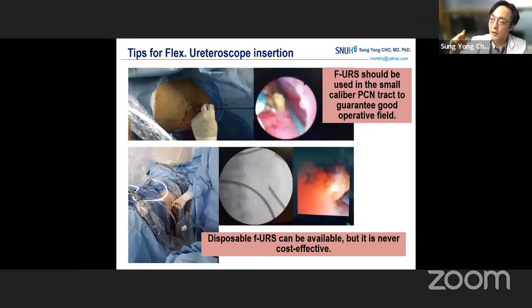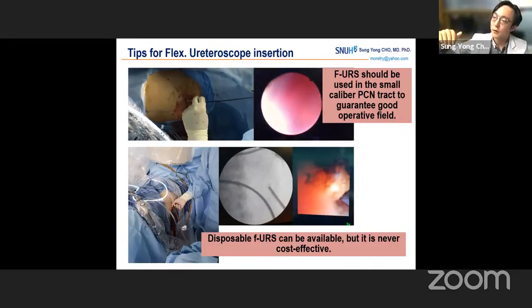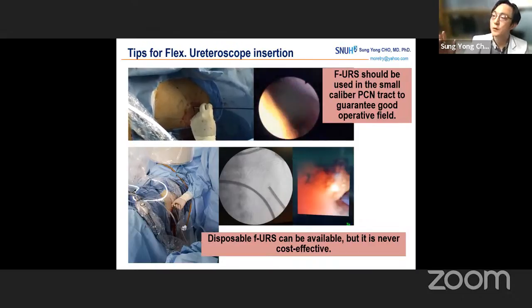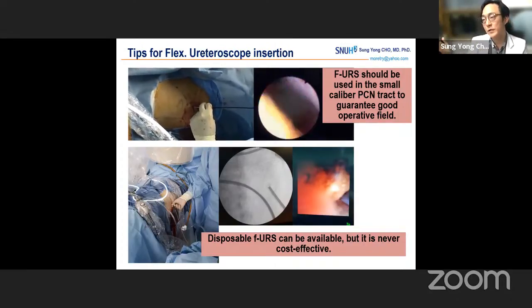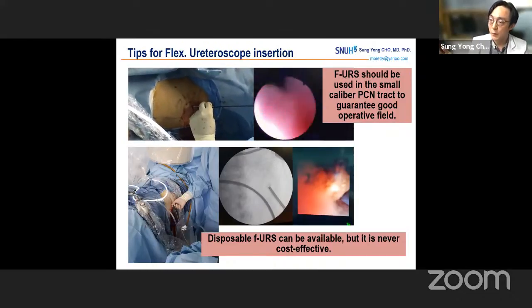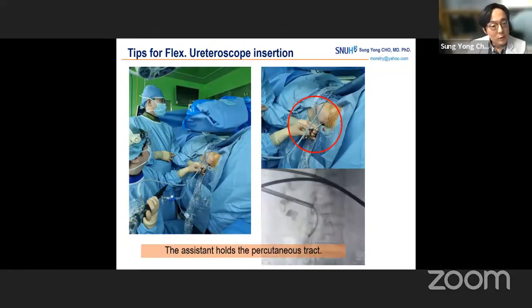So if the percutaneous tract is located in the mid-pole calyx, then the flexion of the flexible ureteroscope to the ureter can make some external damage to the flexible scope. The surgery can be successful at that time, but the next surgery would not be, because of the absence of the flexible ureteroscope with the external surface damage. So in many cases, the assistant has some roles to facilitate this ancillary procedure. I already explained this situation.